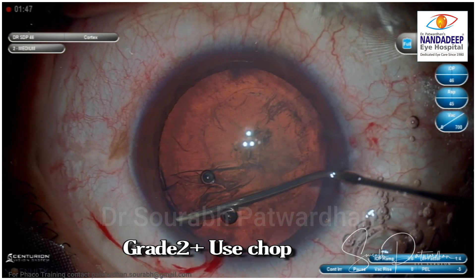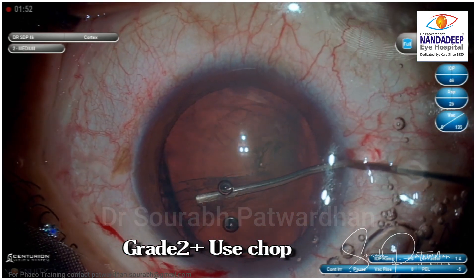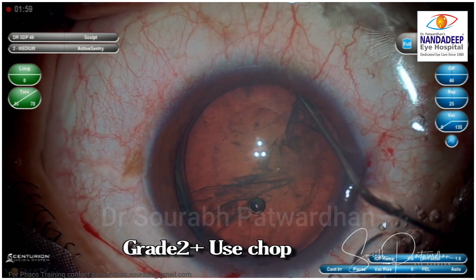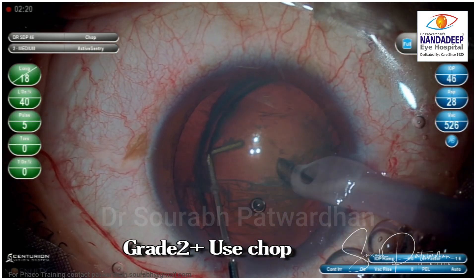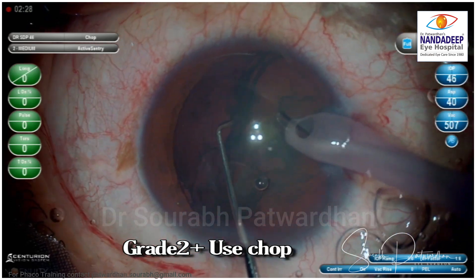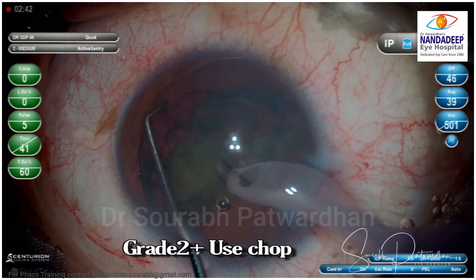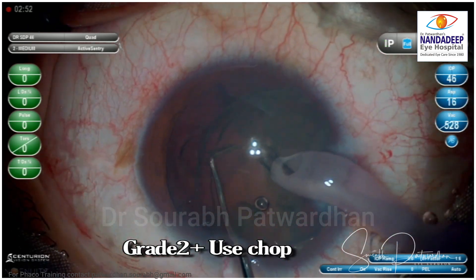The second thing to avoid is using this technique when there is a harder grade of cataract, grade 2 plus. You might sometimes be able to prolapse the nucleus out, but I would advise you to do a feco chop rather than feco aspiration, because you might end up using high energy much more anteriorly. Like in this case, I misjudged the grade of cataract and it was slightly harder than grade 2, so I decided to do a chop. Once you have two hemi-nuclei, you can then do the feco aspiration part.